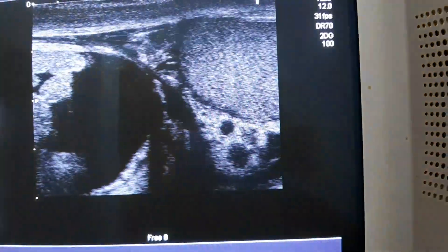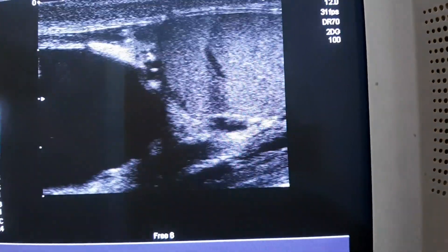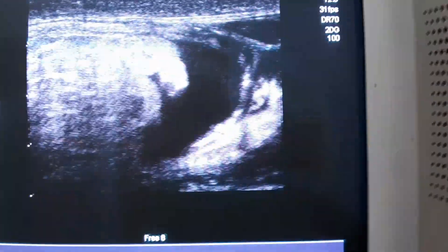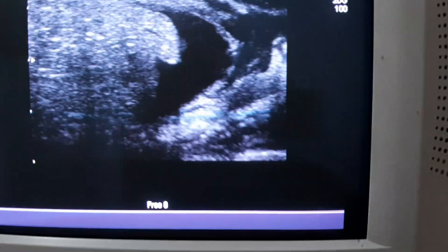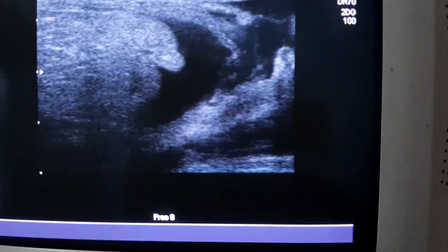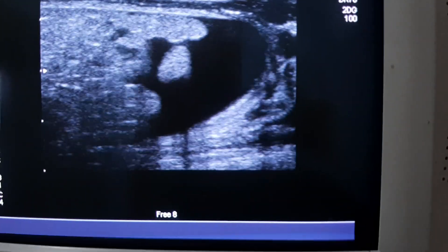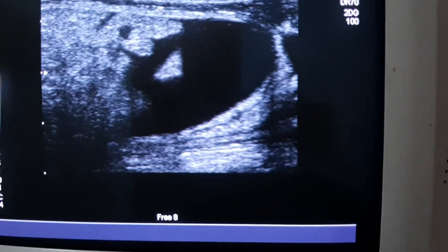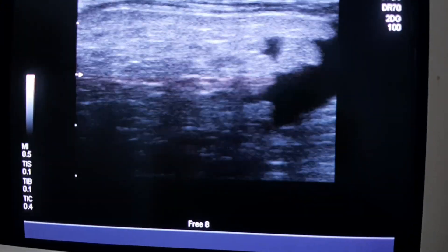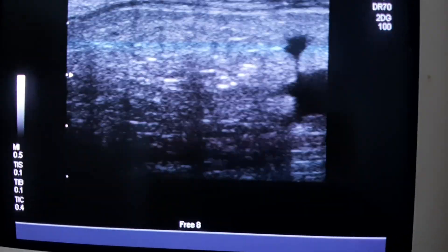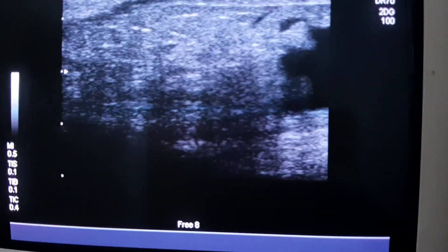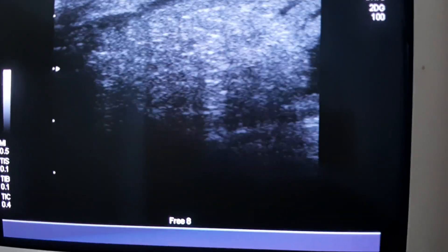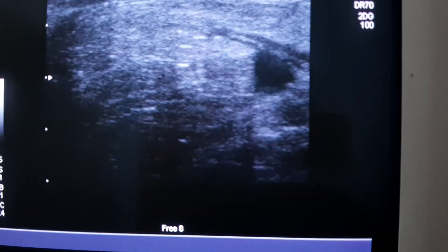This is the normal side testis. If you go above towards the abdominal side, you can see this fluid and these tags. These tags are actually omentum tags. The omentum — there is no gut. So the herniated content is probably omentum.